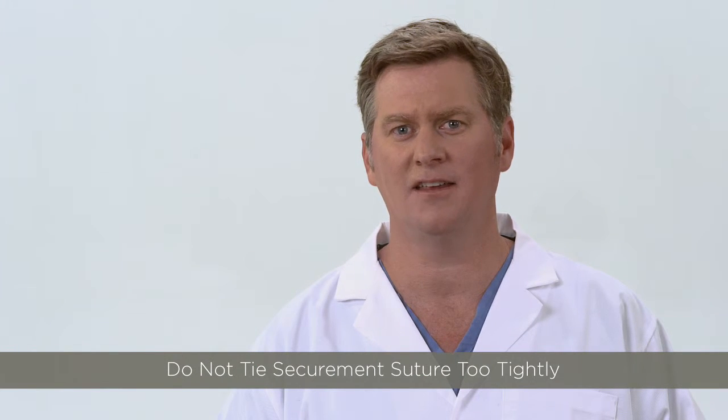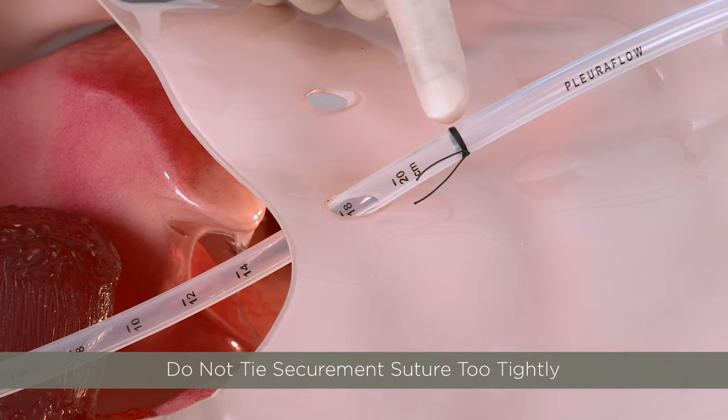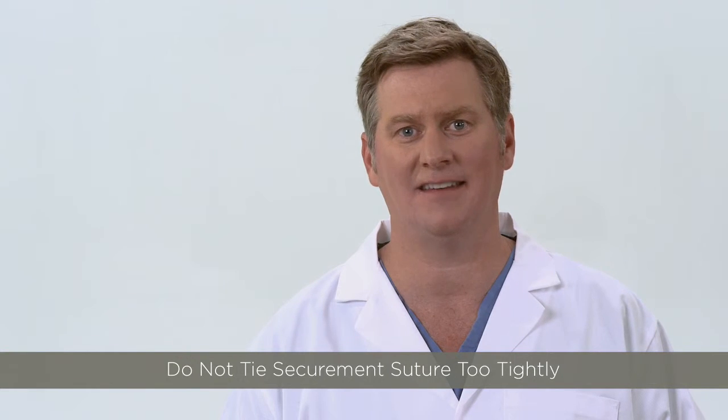Securing the chest tube too tightly to the skin can also dimple the silicone chest tube. Take care not to tie the suture so tight it creates an hourglass-type obstruction in the lumen of the tube at the tie-down site.